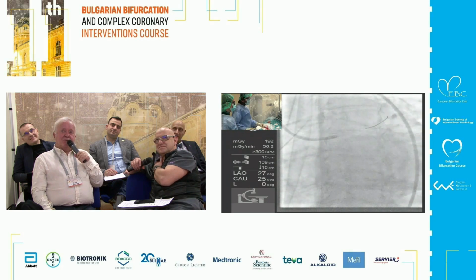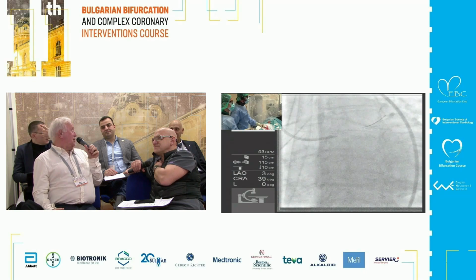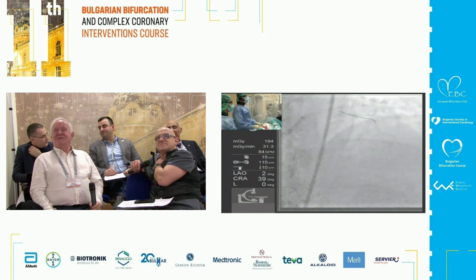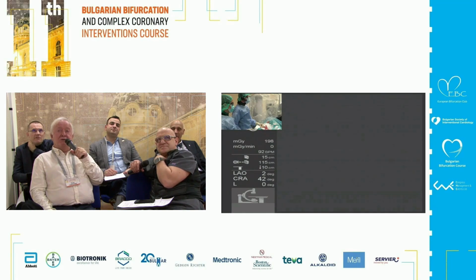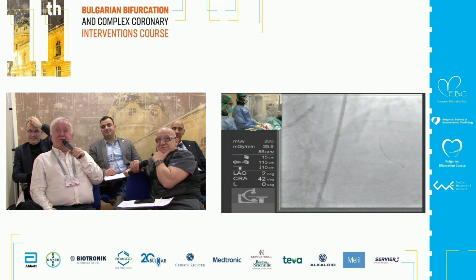Why not? Are you going to AP with a lot of cranial? Yeah, it's a bit of validation. It will be very quick. You cannot go more cranial. How much? Cranial 40 already. No, not a good idea. So 45, yeah, suggested 45. Is it good? Okay, I'll try.